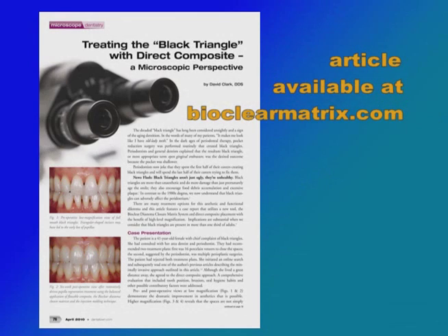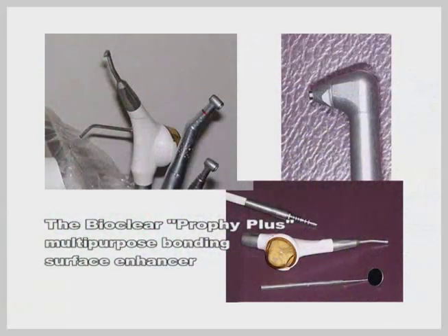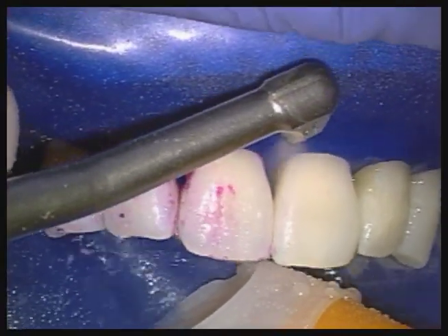Several articles describing this treatment and a full case description are available online at the BioClear website. I like to place disclosing solution to aid in thorough plaque removal. Use of something like the BioClear Profi Plus instrument is far and away the best method to strip away the biofilm and contaminated cementum.